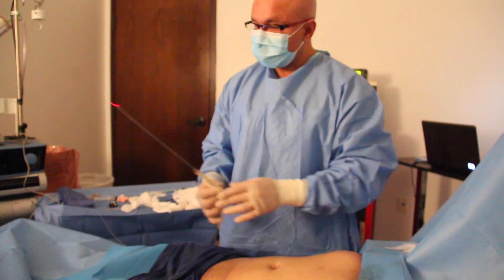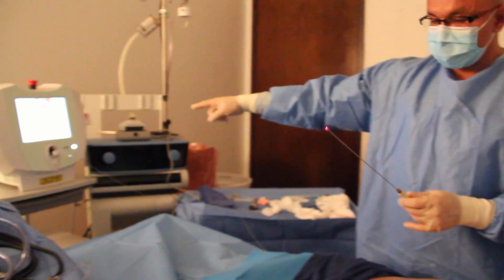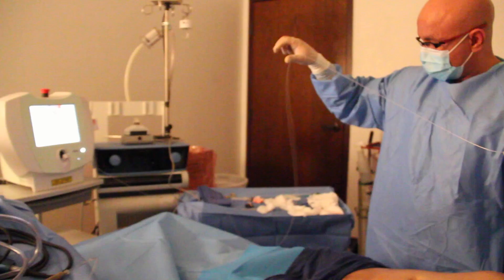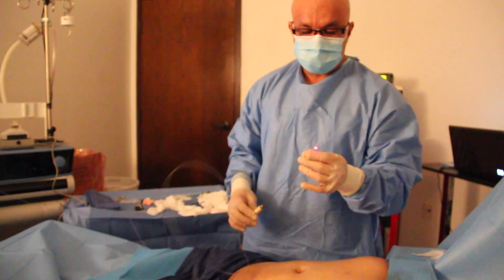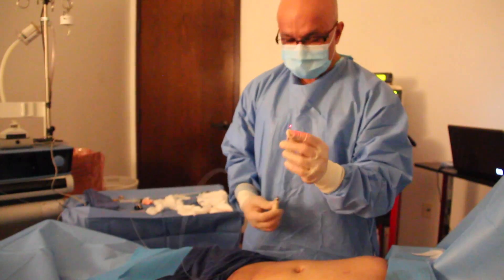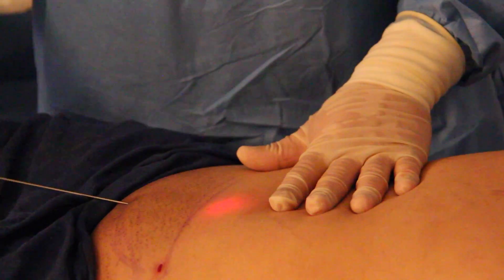This is the laser — that's the laser right there. This is a fiber optic, this is the hand piece, and this is the tip of the laser that goes inside, as you can see.